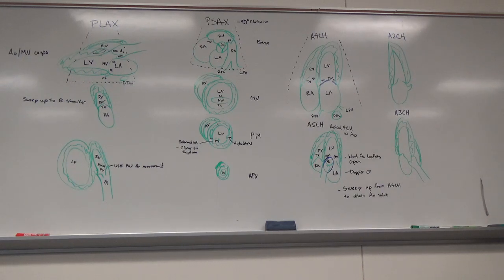So you said for apical, it's indicator towards the floor, but then you said it's tipped up a little bit. Yeah, so if my patient is directly on their side like this, I'm going to be down like this, but slightly tipped up like that. So it's slightly rotated, in line with the tilt of the heart.